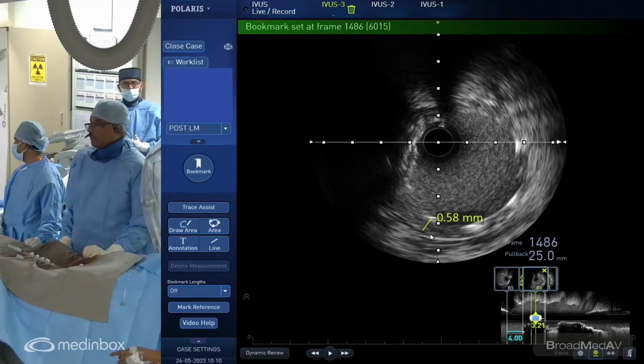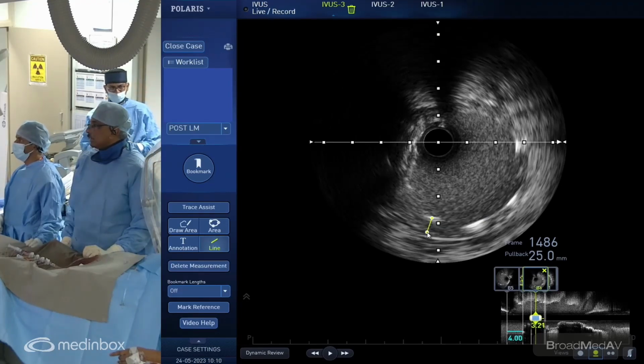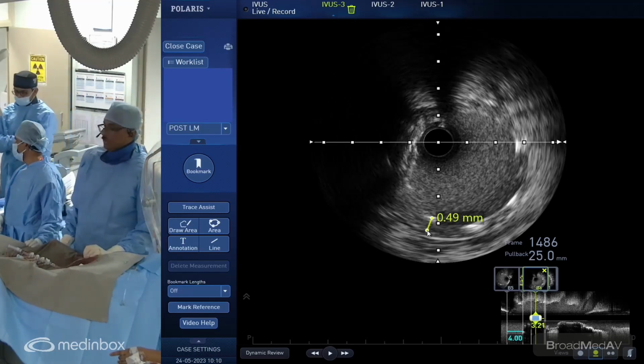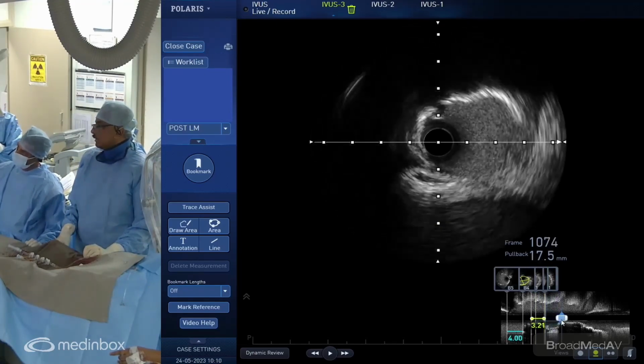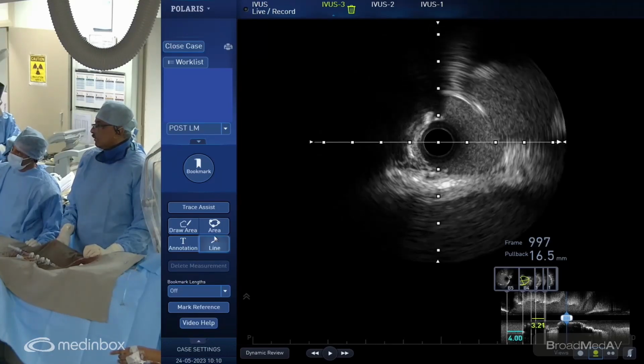What are we giving us? NC Quantum. Okay, that's fine. You need to be very careful as you go in that we don't distort any part of the stent, and that's the key here. Even if we are coming out into the left main, no problem, but we should not go at the distal edge. At least we have to be 3 millimeter away from the distal edge. Can I know how much away are we from the bifurcation, the stent? Is it a millimeter or more?